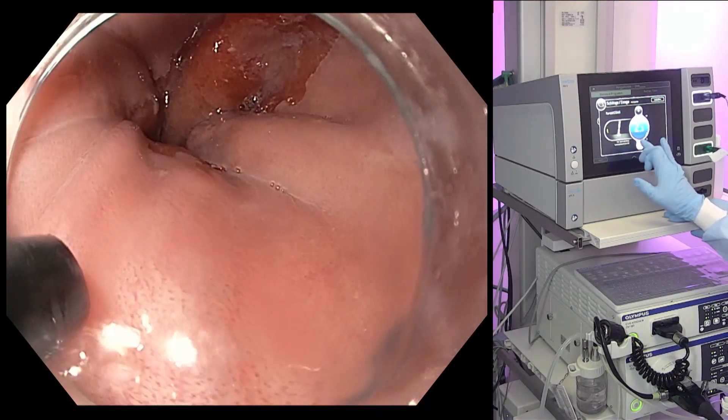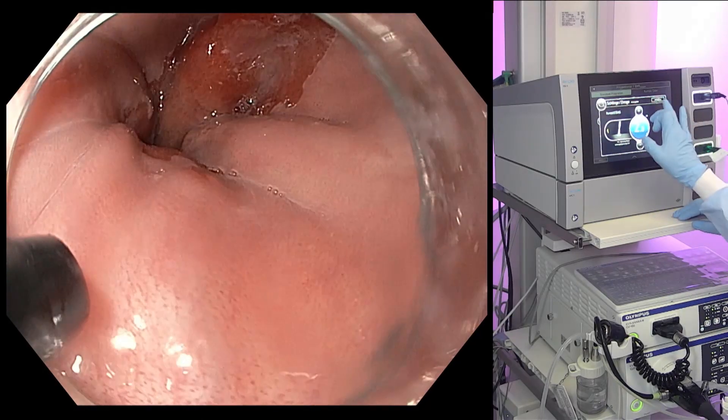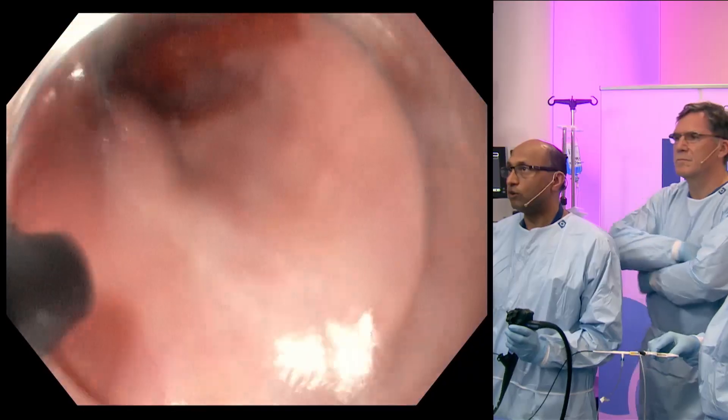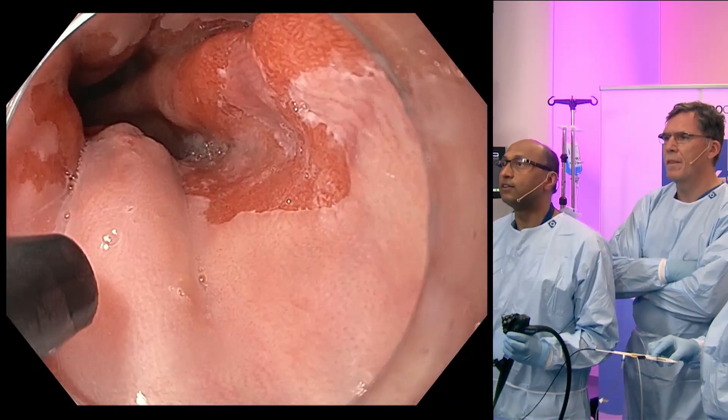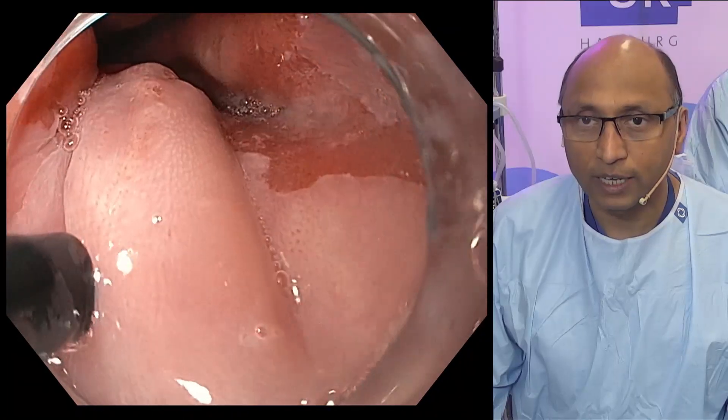For marking we'll use force coagulation. We'll have to mark this bumpy squamous epithelium because we'll have to take this out here.